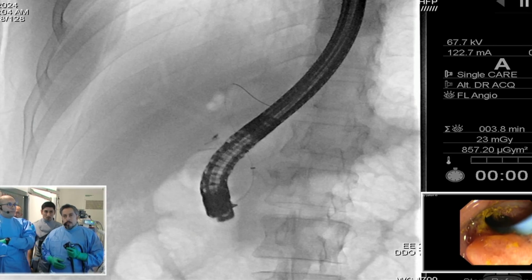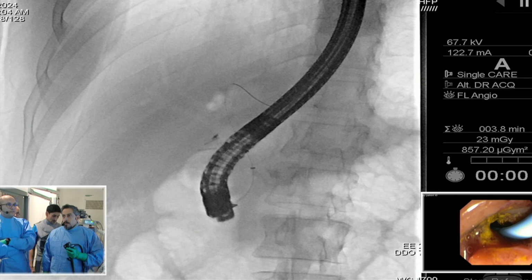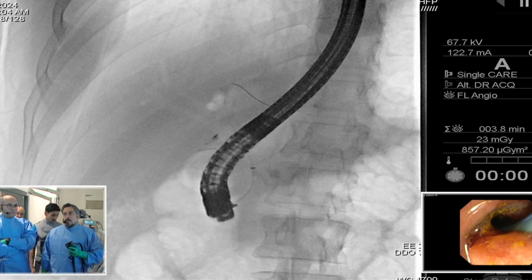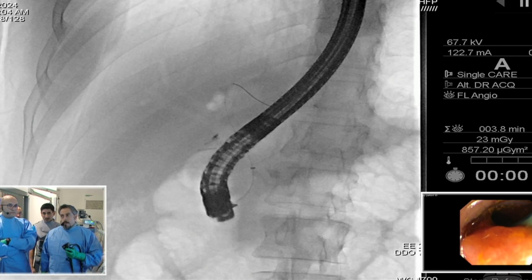There is narrowing with some white and red area without any projections or new vascularization. So that will be most likely inflammatory. I think with his age and stones and the findings in fluoro images and SPY, I wouldn't really biopsy it with SPY bites. That's what I would do. This is clearly most likely inflammatory.